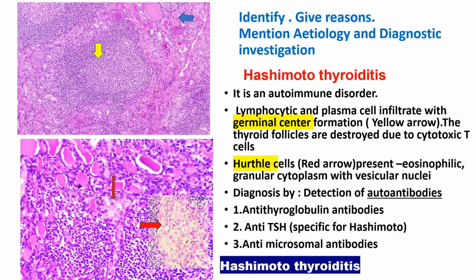So Hashimoto's thyroiditis. Next slide. Identify, give reasons.